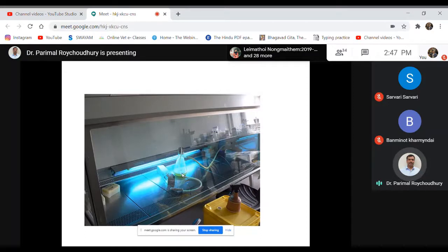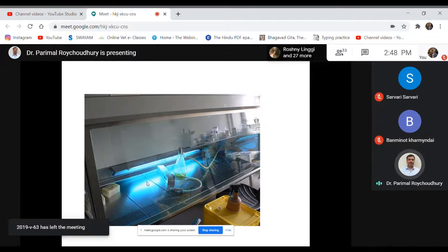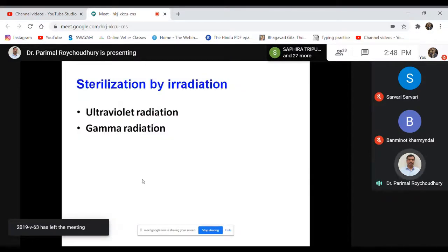If it falls for a long duration on your cornea, the cornea may get damaged. So it is very harmful for our body. The microorganisms can be killed or inactivated by using this UV light fitted to this kind of small area. Even some of the hospitals and operation theaters are disinfected by UV radiation. Remember, small cubicles and rooms can be disinfected by ultraviolet light. So gamma radiation can assure complete sterilization, whereas ultraviolet radiation mostly causes disinfection of an area, a room, or a surface.